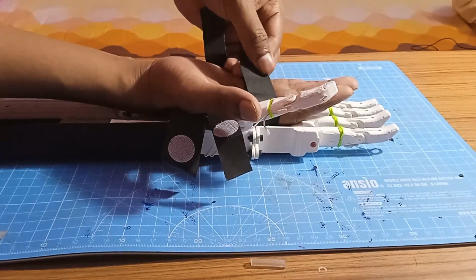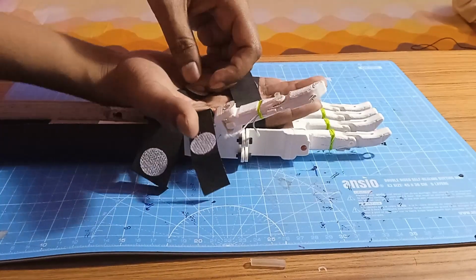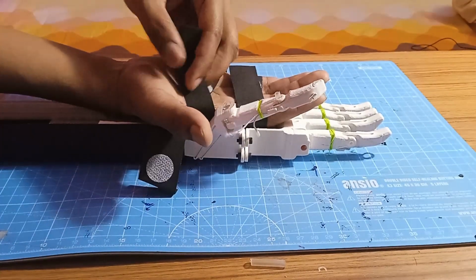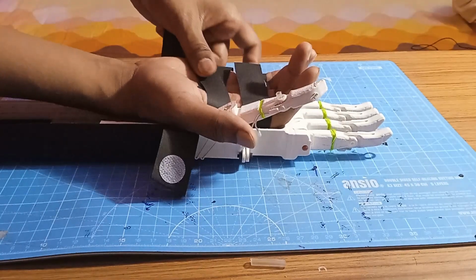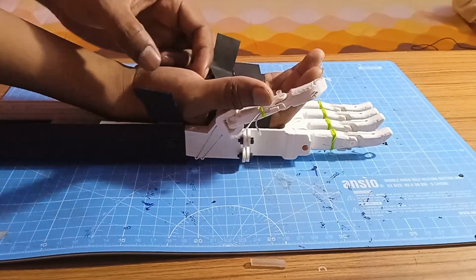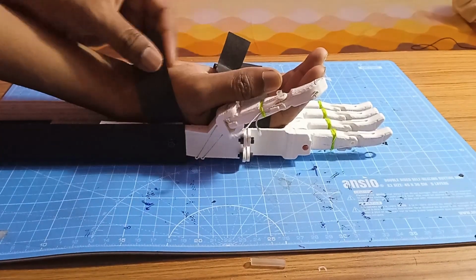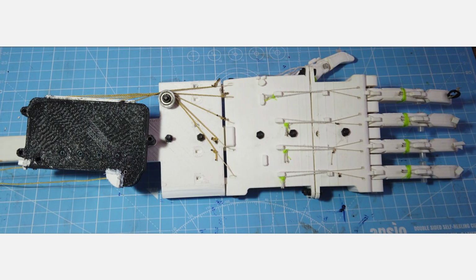Summarizing the conclusion, a prosthetic arm was successfully designed in a CAD software and a new mechanism was successfully added. Then all the G-code was created for the prototype, which can be used for further recreation of the design prototype, and it can be improved further for real-life usage. The finished 3D printed prototype was created successfully.